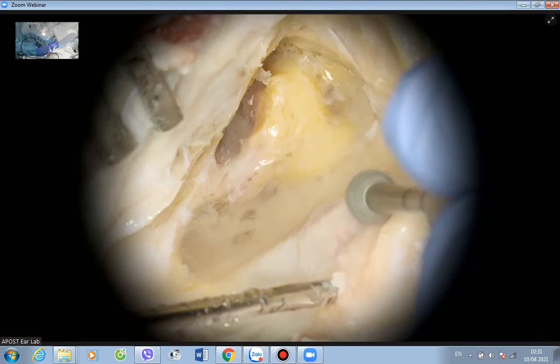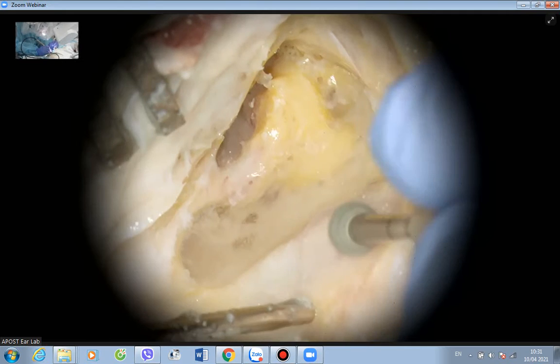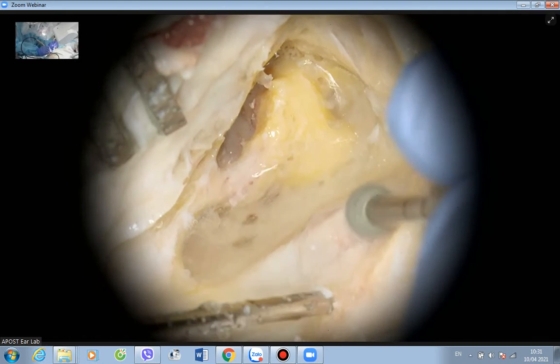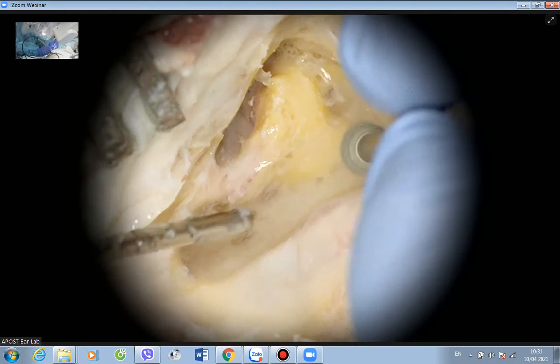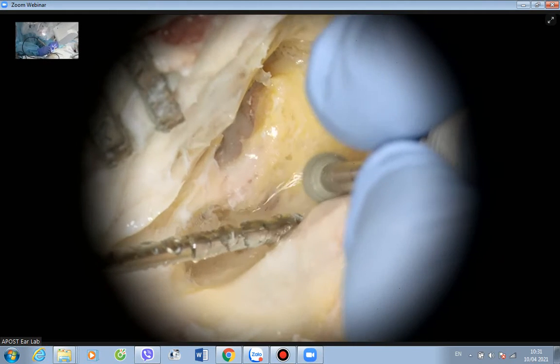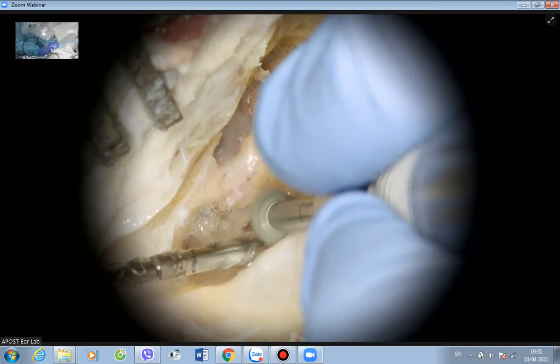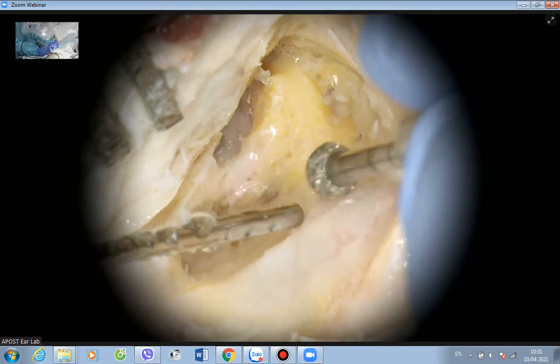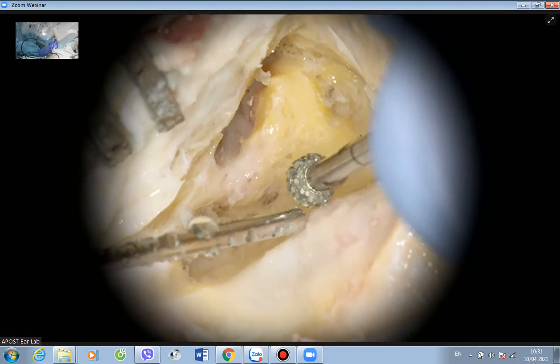And then I don't only remove one single spot. If you only remove one single spot, then you will puncture a hole. So you polish all the way, polish until really, really thin behind it, leaving one single island of bone here, and then you gently compress on it.